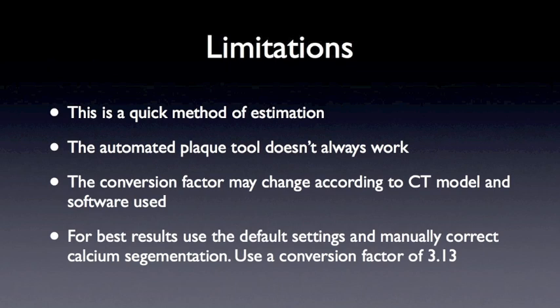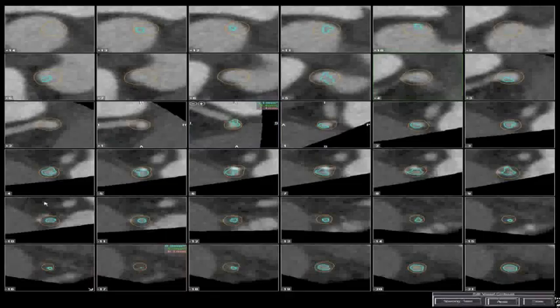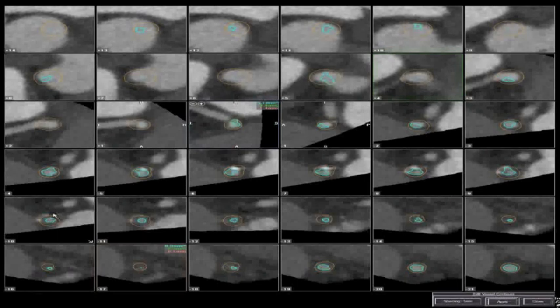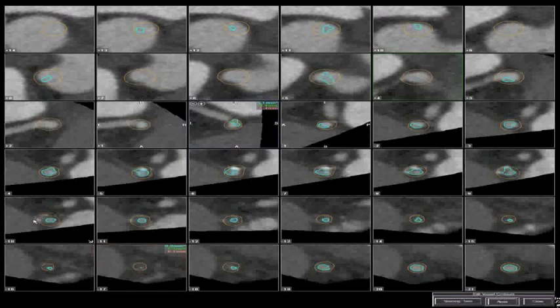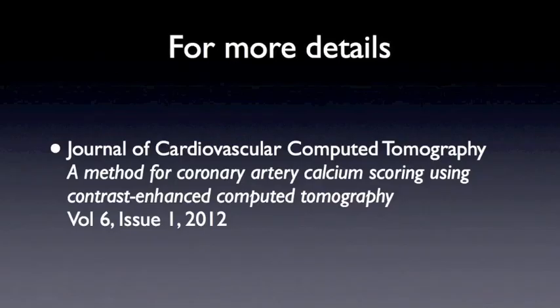Using this method, you will get results close to the repeatability limits of calcium scoring itself, and here I demonstrate manually adjusting the contours with the Vitrea software. The details on this more accurate method you can see in our publication in the Journal of Cardiovascular Computed Tomography.